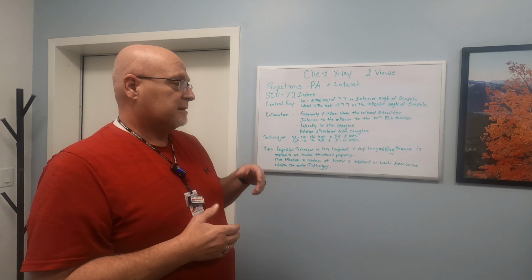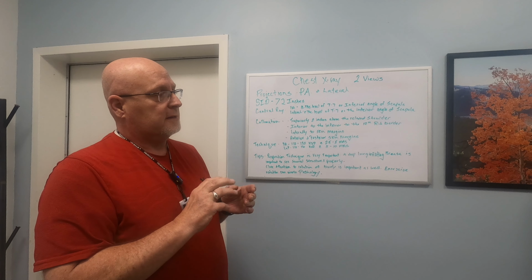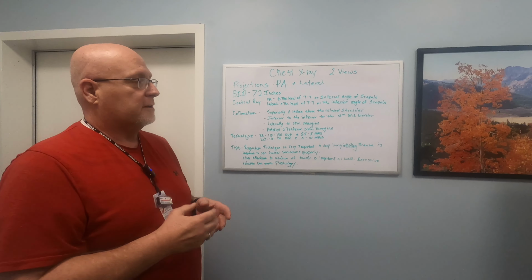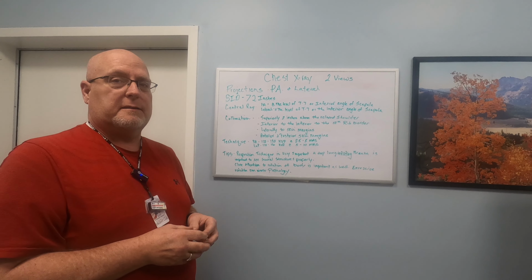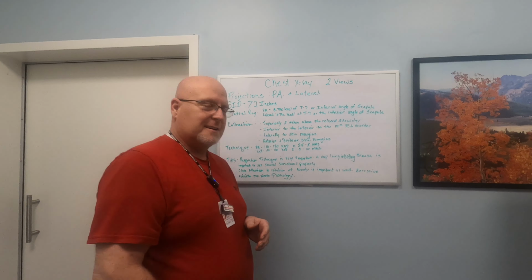Okay, we need to pay close attention to not have any rotation. If you have rotation on a chest x-ray one way or the other, it can show your heart bigger than it actually is. And a couple other structures may look a little bit out of whack if we are rotated too much.